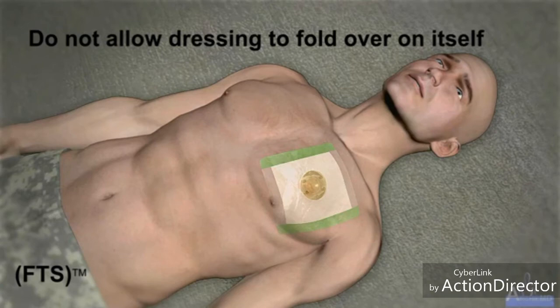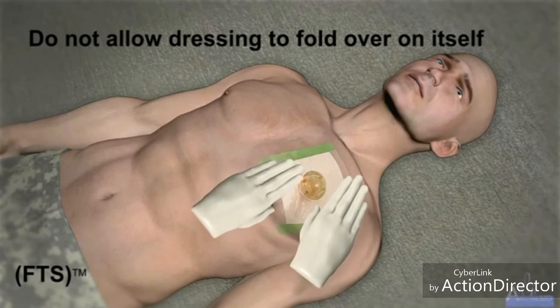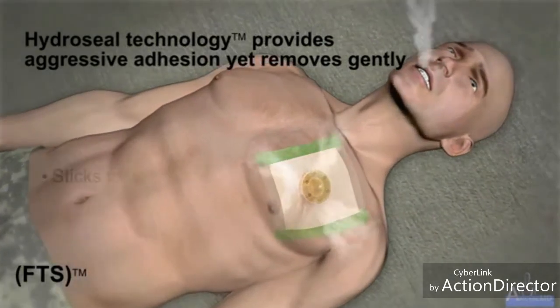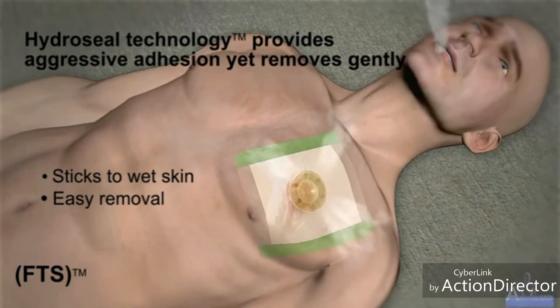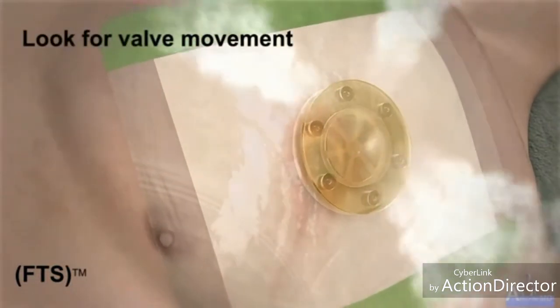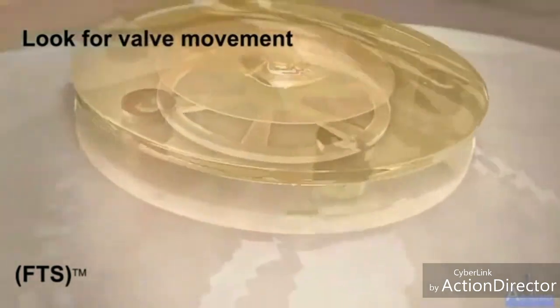Confirm occlusion and placement by applying firm pressure across the dressing's entire adhesive surface. HydroSeal technology provides aggressive adhesive yet gentle removal. The HydroSeal technology sticks to wet skin and allows for easy repositioning if needed. Look for valve movement. Opening and closing valve movement indicates successful placement.